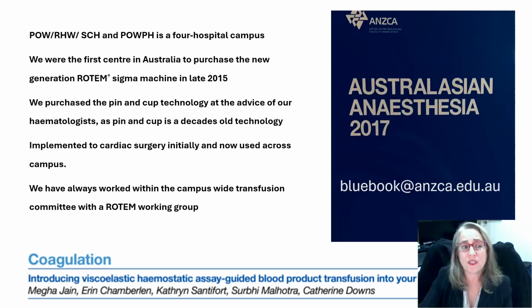Each little centre needs to work out their own way to do this and to make it work with what they have. So we purchased the pin and cup technology because that was at the advice of our haematologists, because the pin and cup was a decades-old technology. And back in 2015, the plate system was new. Of course, now there's quite a lot of evidence around all of that. But we implemented it first into cardiac surgery. It's now used across the campus.